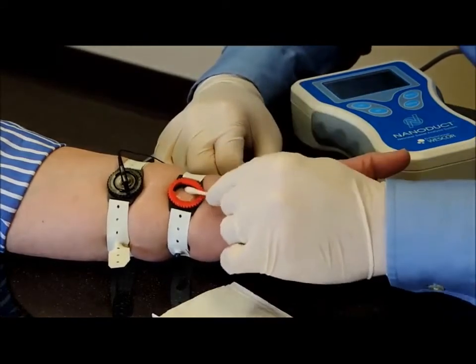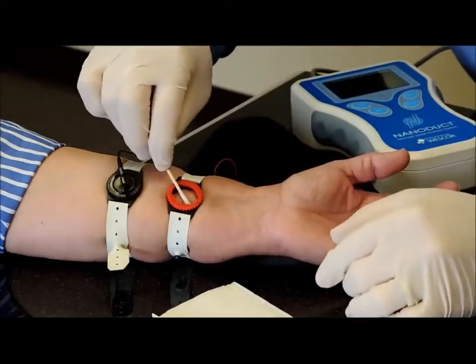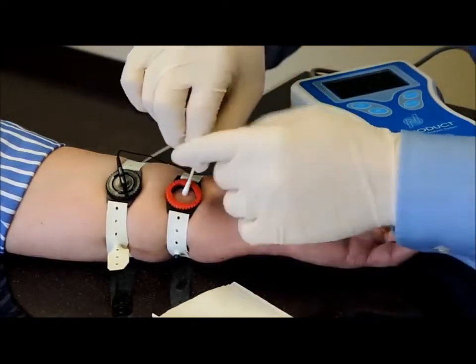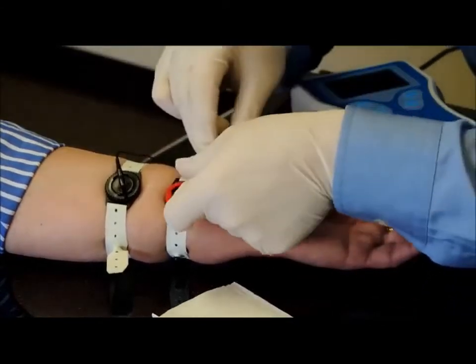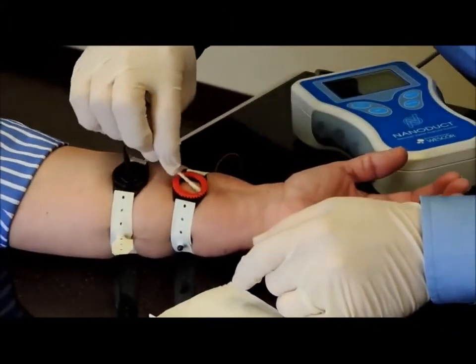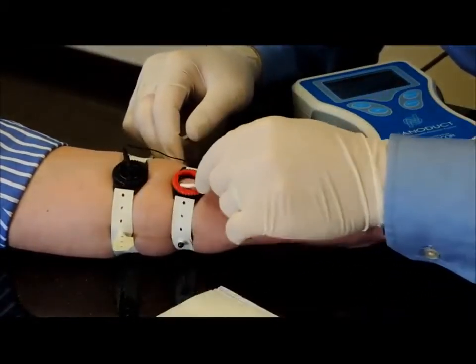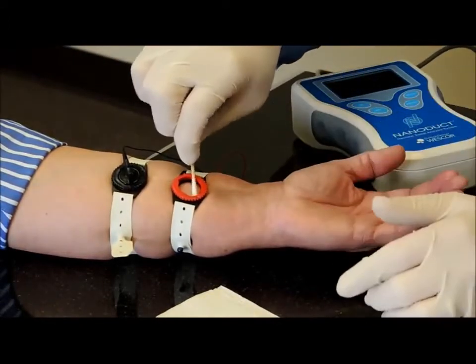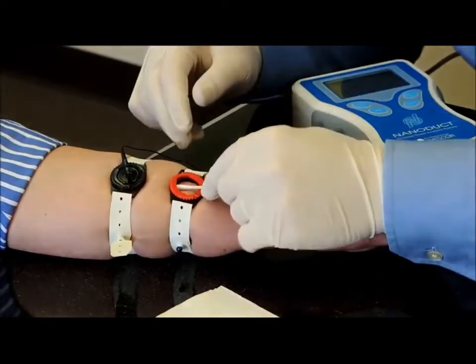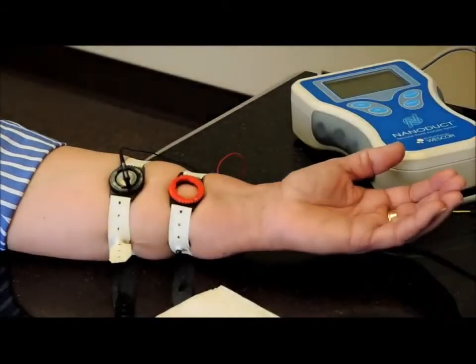Now, one thing that's really important is to use a few of these swabs and make sure you dry that really well after it's been wet, and get underneath the holder all the way around, because some of that liquid can go underneath that holder. You want to just make sure that's really dry. You can see when it's dry. The cotton absorbs the liquid really well. So we're back dry as we should be.